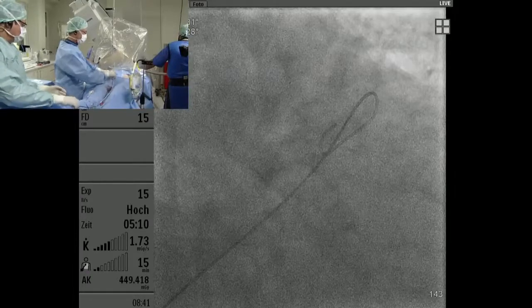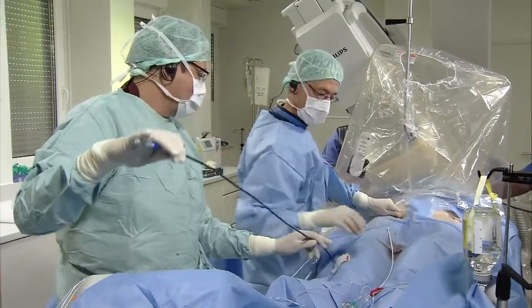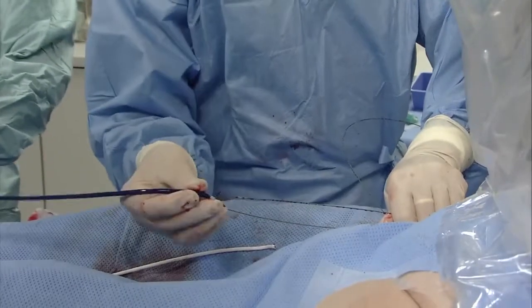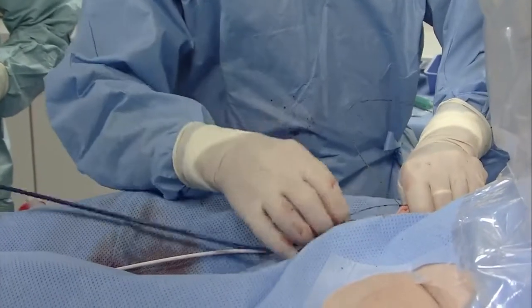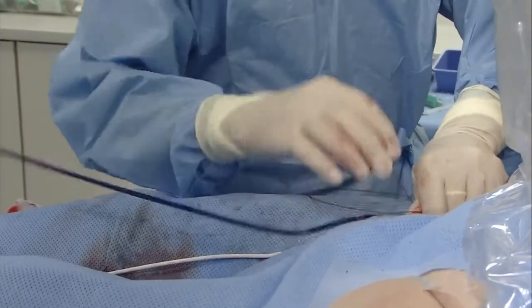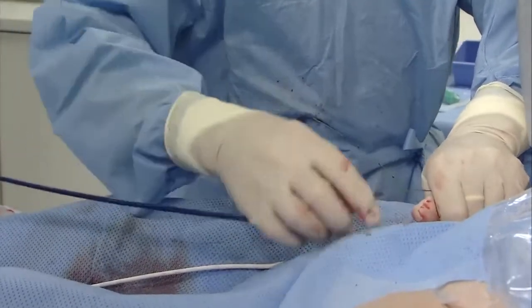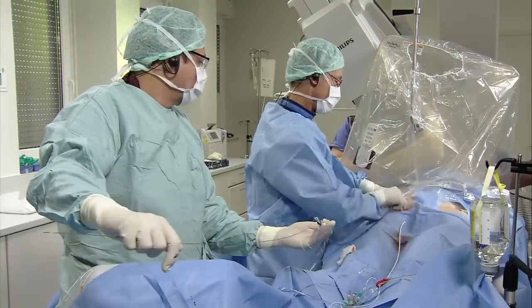Kevin, would you use a double curve or any? Yeah, I think the 45 by 45 is used for all of them now. But Kevin, you have used the ASD sheath in the past. Yes, exactly. But I think with the amulet, it seemed to change, and it wasn't easier to get alignment of the lobe with the axis of the appendage.